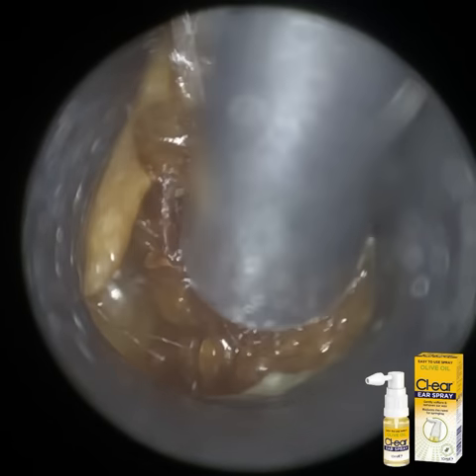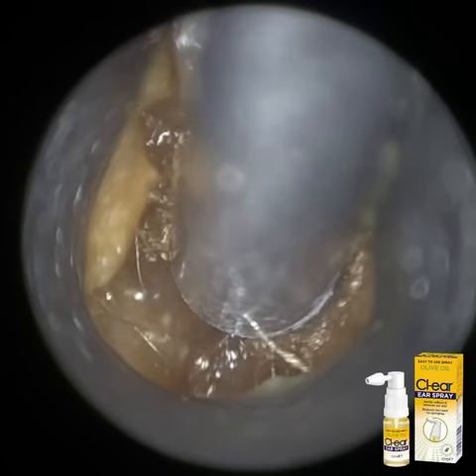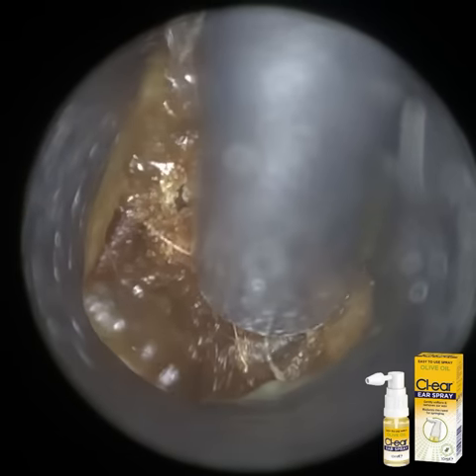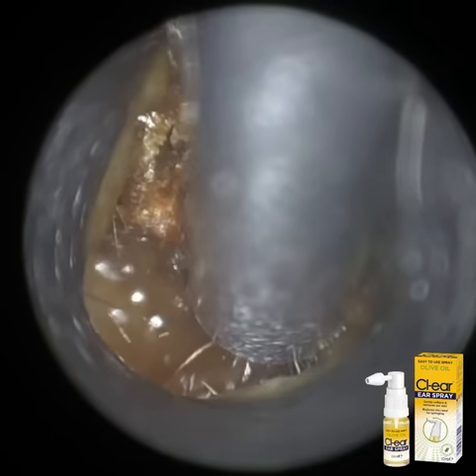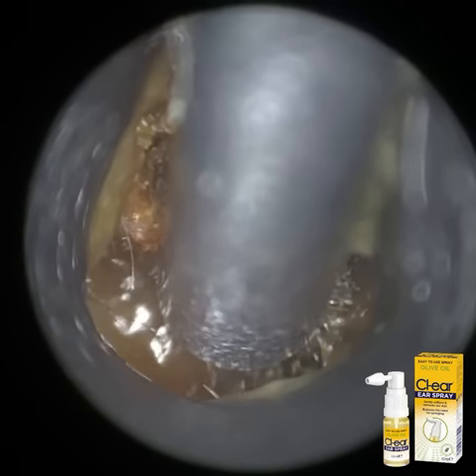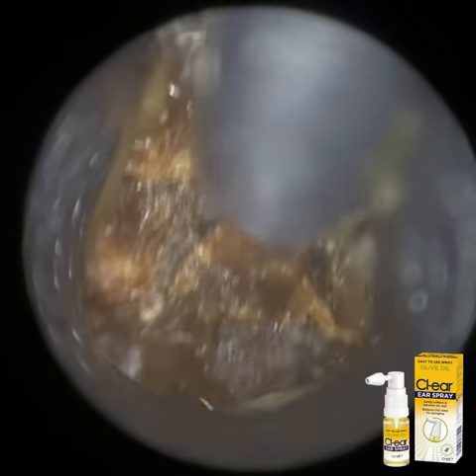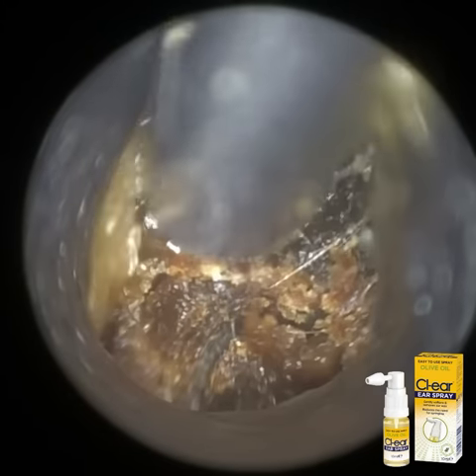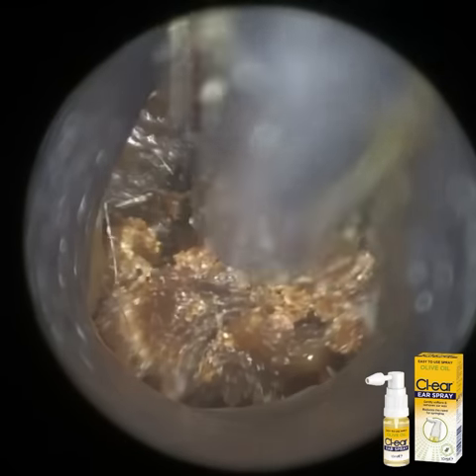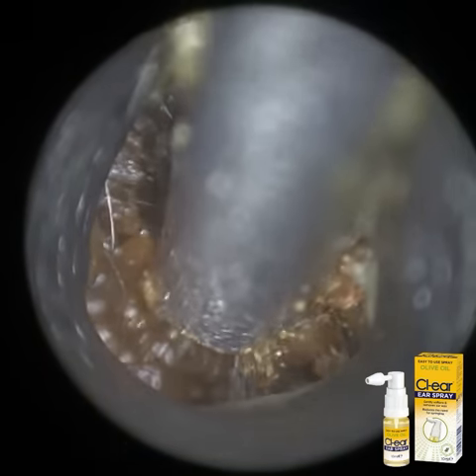So we have here a patient who attended with a really blocked left ear, and this earwax is medially impacted, so towards the eardrum. It's quite firm in consistency and texture. They had been using some drops prior, but although it softened the surface of this wax, as soon as you remove that, you can see it's quite firm and solid.